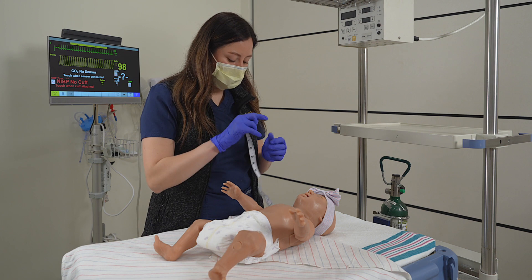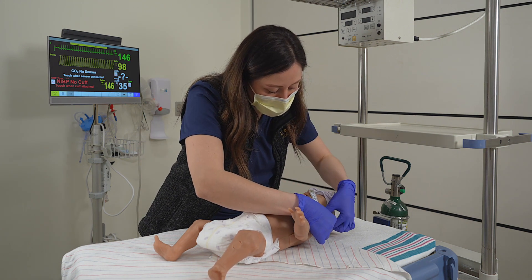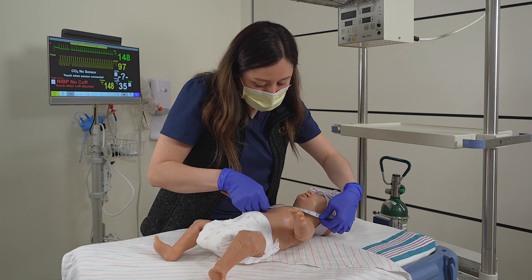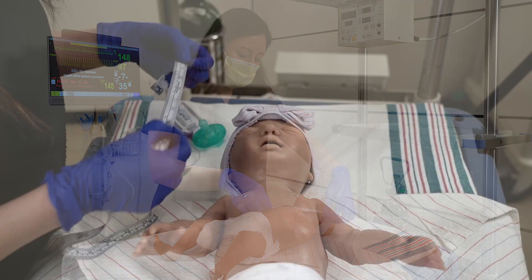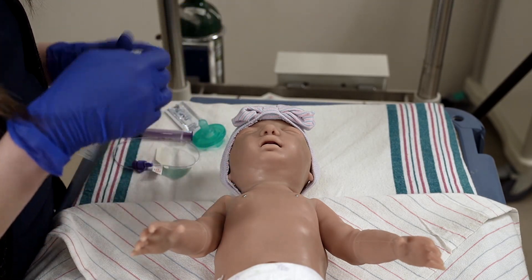Place the infant supine and, using your measuring tape or NG tube, measure the distance from the tip of the nose to the earlobe, and from the earlobe to below the xiphoid process. Note the centimeter marking at the pre-measured depth of insertion.